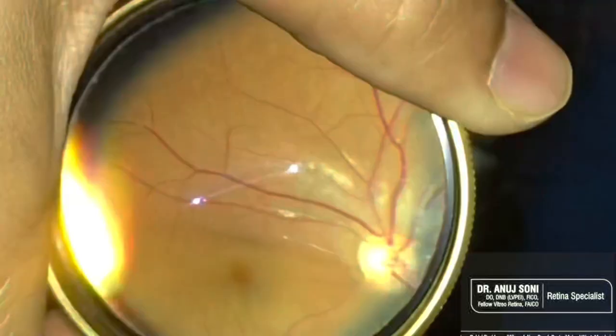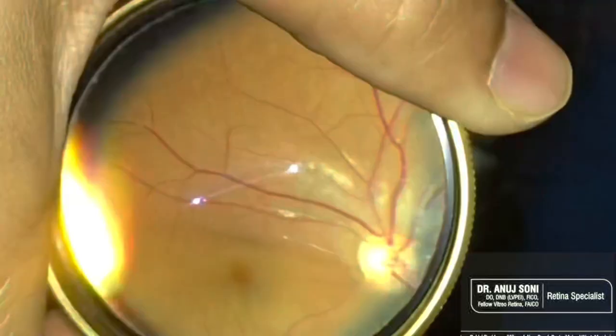Remember, only the orientation changes. That means, if the patient is looking up and you are examining the superior periphery, then it is indeed the superior periphery. Only the orientation of the lesions or the blood vessels is changed.